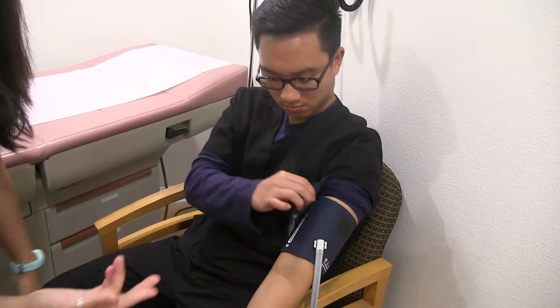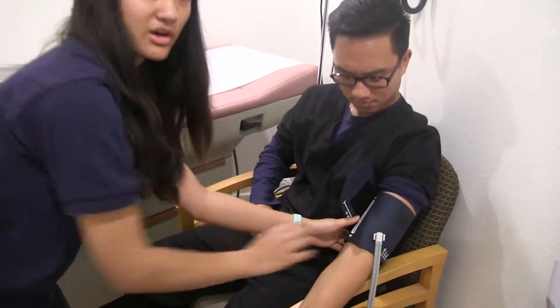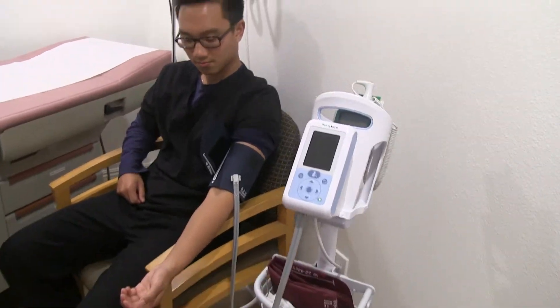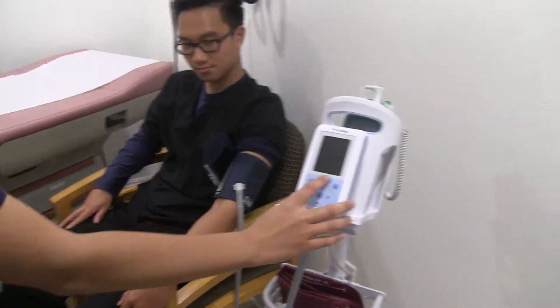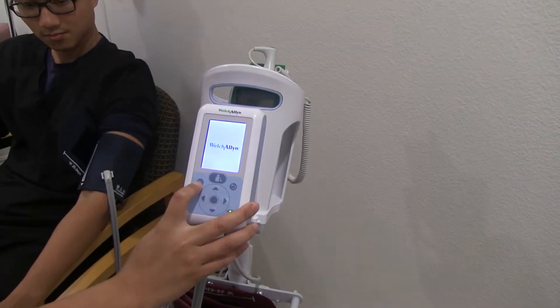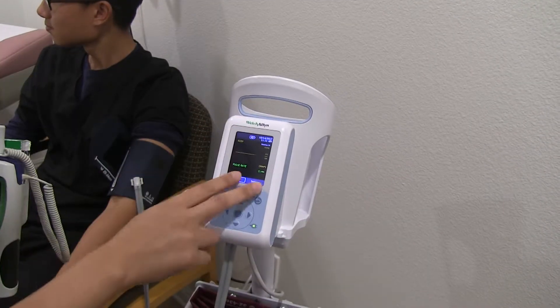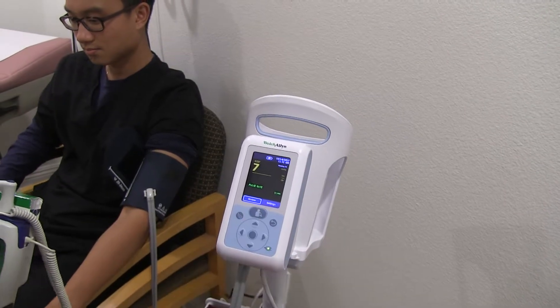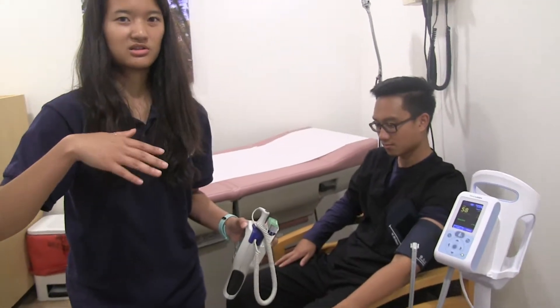Make sure the cuff is snug. The general rule of thumb is you should be able to put two fingers in, but it should be tight enough where it doesn't roll around. After you put it on, make sure the patient's feet are flat on the floor and the arm is relaxed on the chair. Turn on the machine, and once it's ready, press the button to take their blood pressure. Make sure the patient isn't talking during this time, or else their blood pressure will constantly fluctuate.